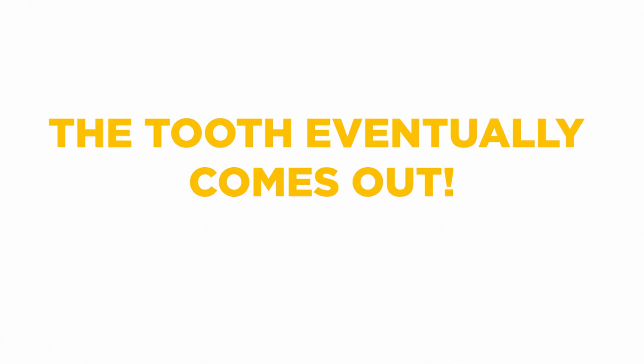And this outcome was to be expected, since even a little bit of pressure with the forceps gives a tremendous amount of pressure to the tooth. You don't believe me? Try putting your finger in the forceps and lightly squeezing the handle with the other hand. You'll instantly know what I mean. Anyways, the crown pops off. I'm still using the cow horn because I still have access to the furcation with it. But to my surprise, the tooth eventually comes out.